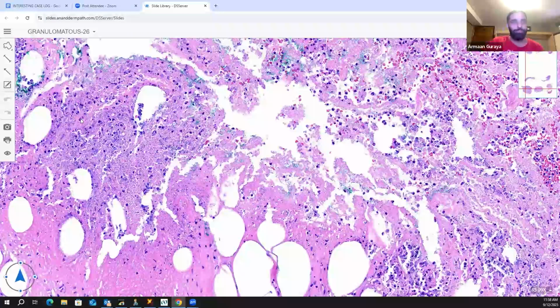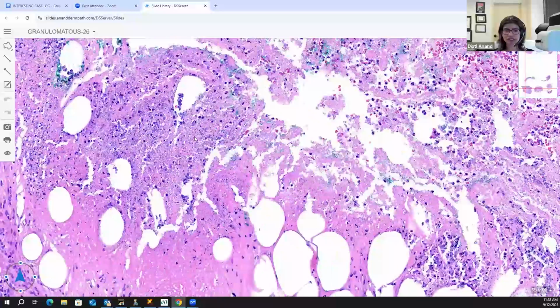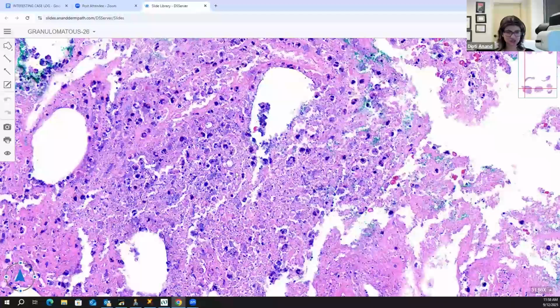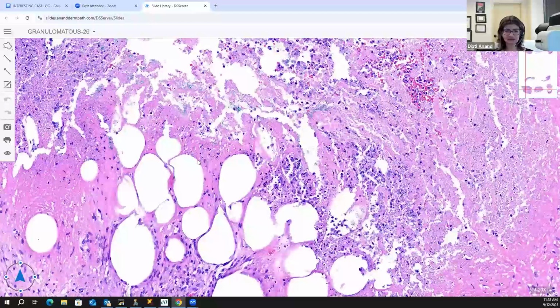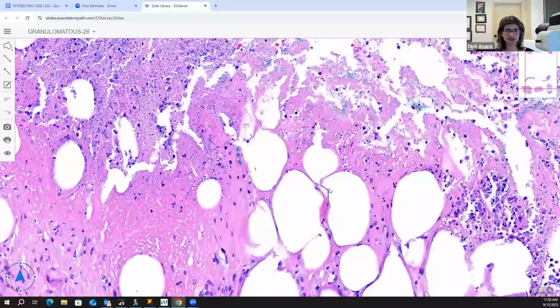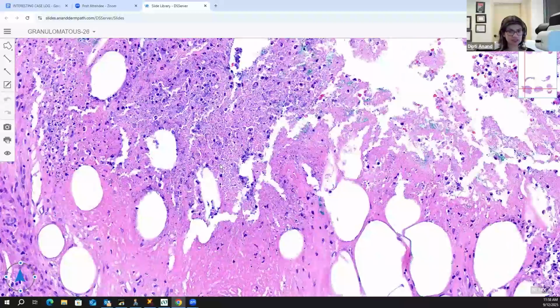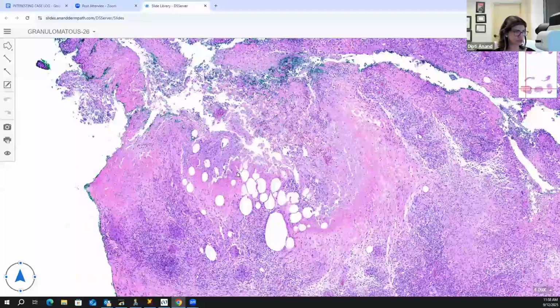Okay, good. So we were talking about neutrophils, right? And we were talking about this is dead tissue. Does it look like healthy dead? Everything dead is bad, but this looks like it was creamed up and died, right? It looks really dirty. This is called dirty caseating necrosis.